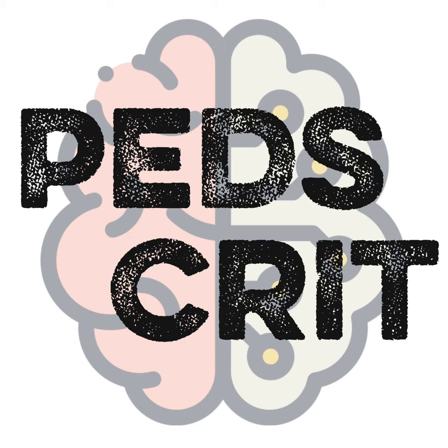If you have a really weak ventricle, it's not going to be able to eject blood across the aortic valve. So you're going to have progressive distension of the LV. You're going to have distension and left atrial hypertension. And that's going to lead to backflow of blood into the pulmonary veins, causing congestion there that may cause frothy secretions, the same way they might see pulmonary edema clinically. Those patients, you want to monitor them closely with an echo and just clinically. And if there is evidence of left atrial hypertension, that would be when a LA vent or some other method would be indicated. Right.